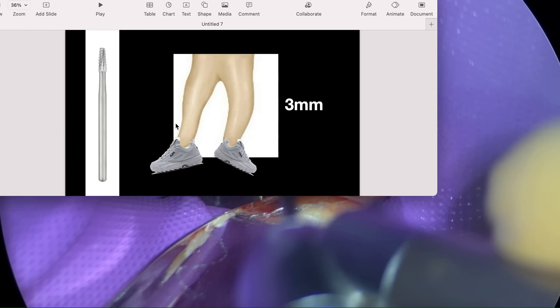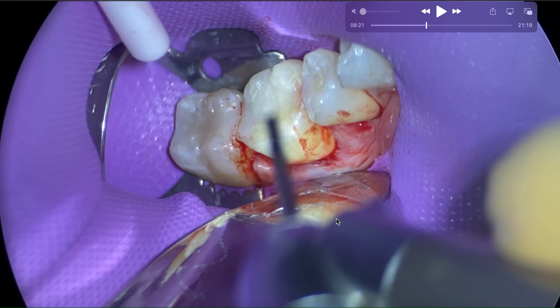What we're going to do is cut the crown off, and then section the root. Because if you try to section the entire tooth from the crown — that's 11 millimeters — it seems like when you come out of dental school, no one shows you this technique. What I used to do is section right all the way through those 11 millimeters. Then you become fearful — you either miss the section and go too far distal, or you're scared and don't cut deep enough, so you fracture half the tooth and lose your landmarks. But if you cut the crown off and your tooth roots have curves, you're actually only cutting through maybe three millimeters of root structure. So let's play this out.